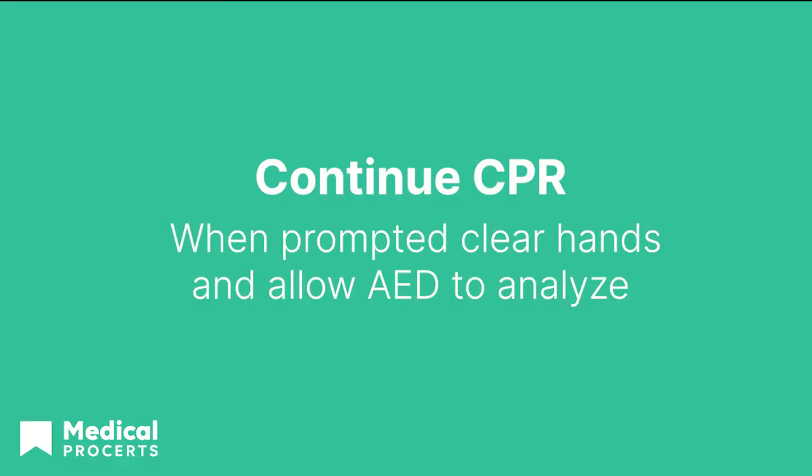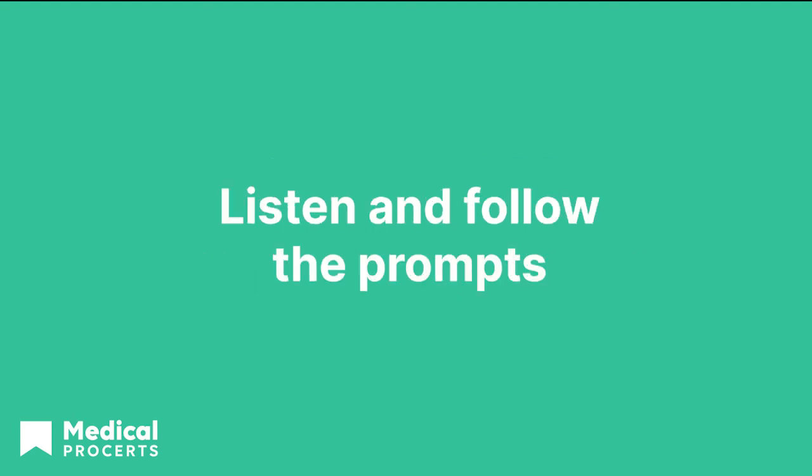Continue CPR until prompted and allow the AED to analyze the heart rhythm. This should take up to 15 seconds, and continue following the voice prompts. If the AED prompts you to check electrodes, check for contact. Remove any obstructions, press the pads firmly down, or replace them if needed.